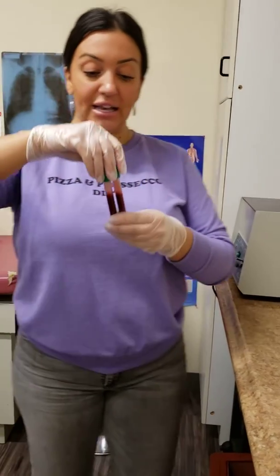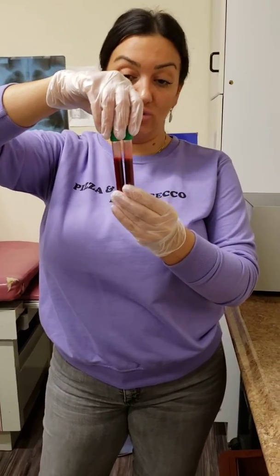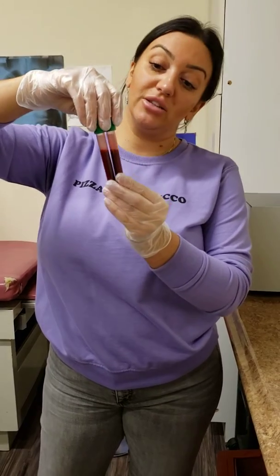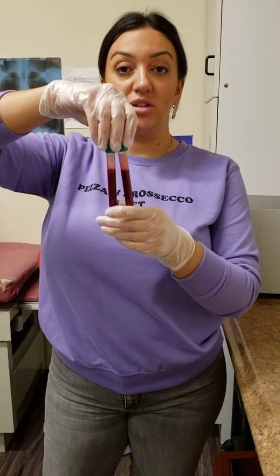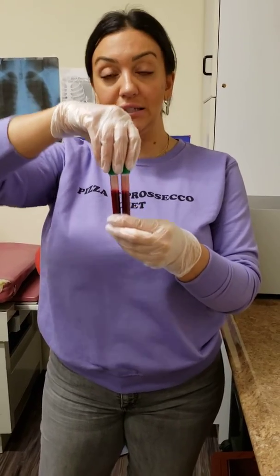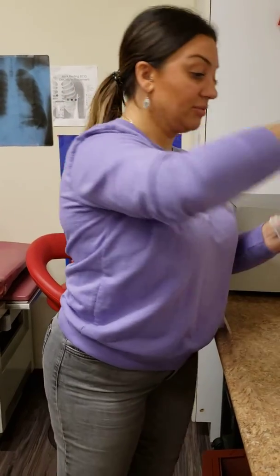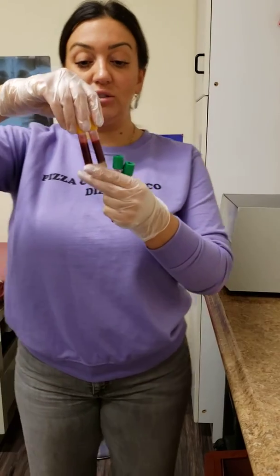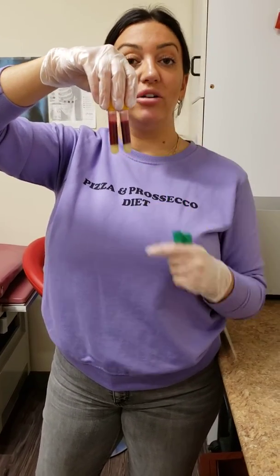Now, I have the exact same amount of blood in both of these tubes, which tells me that I did my draw properly because these are both filled completely and they have the exact same amount. This also tells me that these will be balanced when I place them in the centrifuge because they contain the same volume of blood. My serum separator tubes were also filled properly because they again have the same amount of blood in them.